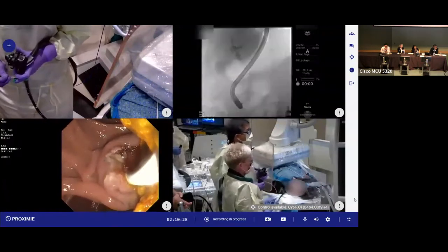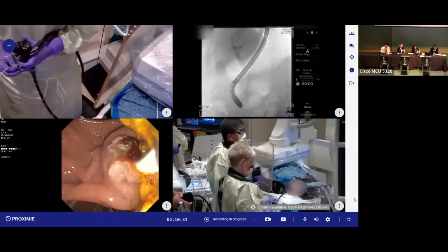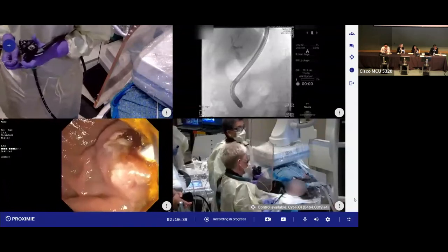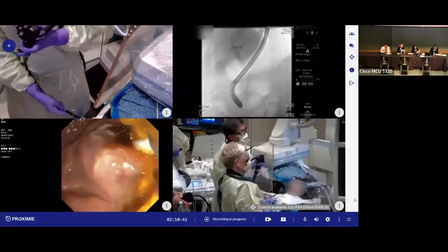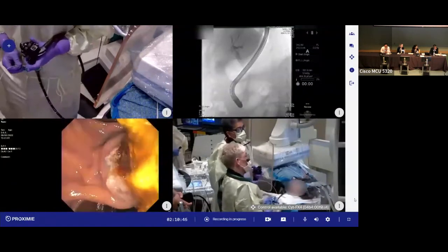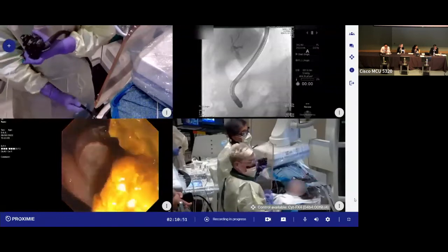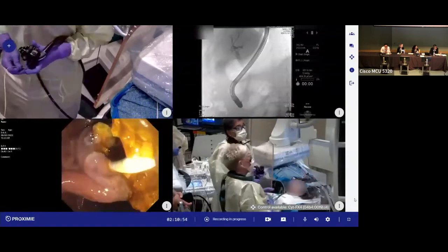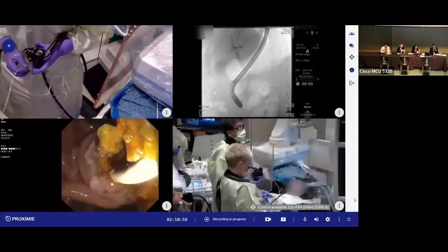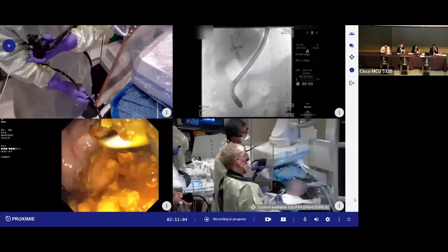And then also if they're younger patients, which this is, how old is she? Okay, that's very young. I would say that I tend to be a little more judicious in my extent of sphincterotomy. Younger patients, I tend to do a little bit more and do a complete sphincterotomy to try to reduce the risk of sphincterotomy restenosis. Go to 9 here. I don't know if that makes sense, but I'd be very interested to hear other people's opinion regarding that.